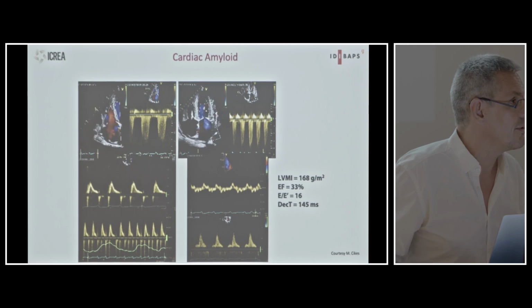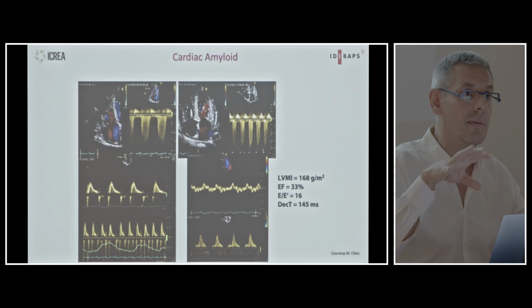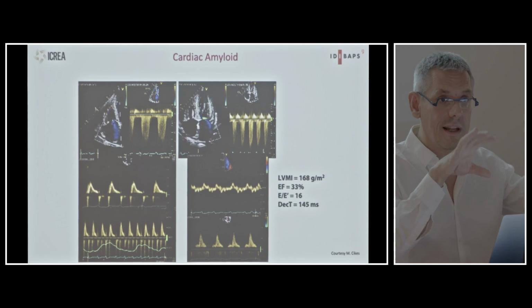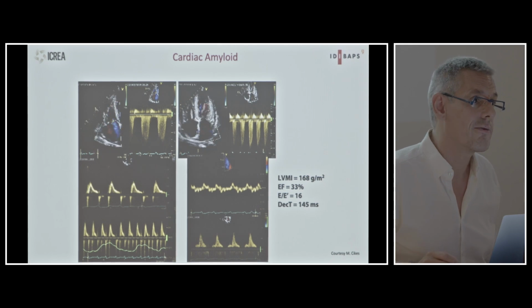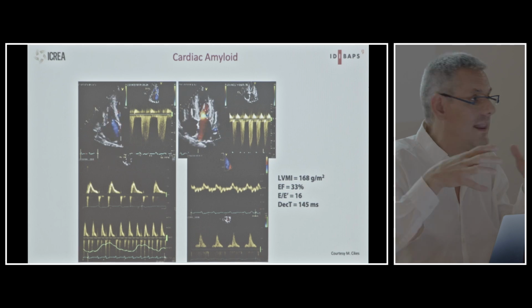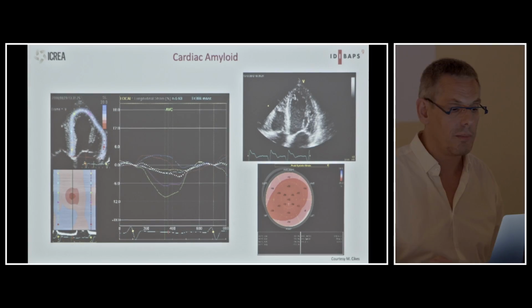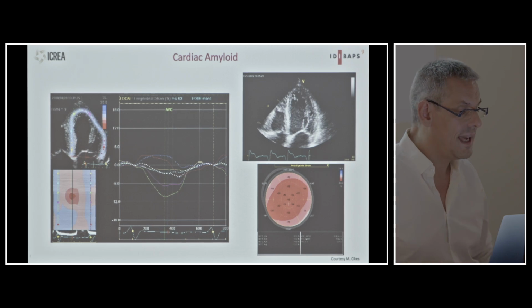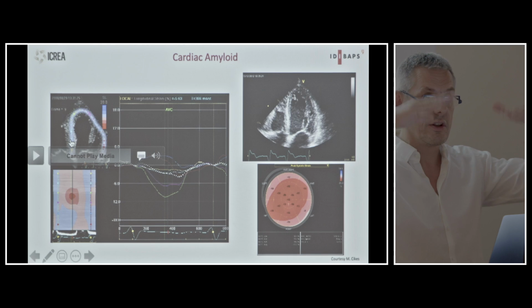Not that they're in atrial fibrillation, but actually I think honestly that there's an activation problem of the left atrium, specifically because of the deposition, of course, of the amyloid. And actually this is what they die from, because if they really lose all their early filling and the atrium is not contracting, obviously they're not filling, and that's their biggest problem. So when you look at the strain patterns, as I said before, overall there's no longitudinal motion.